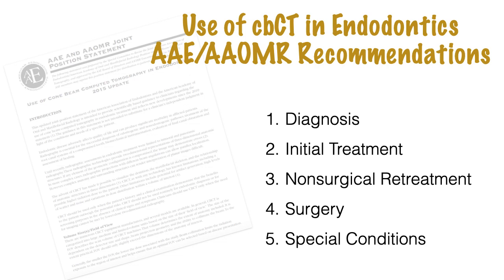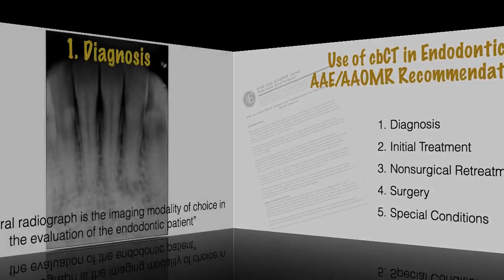So in terms of interpretation, there is a longer section in the document talking about the use of CBCT in endodontics: in diagnosis, in initial treatment, in non-surgical retreatment, in surgical cases, and also in special conditions. Let's have a look at each one of them.